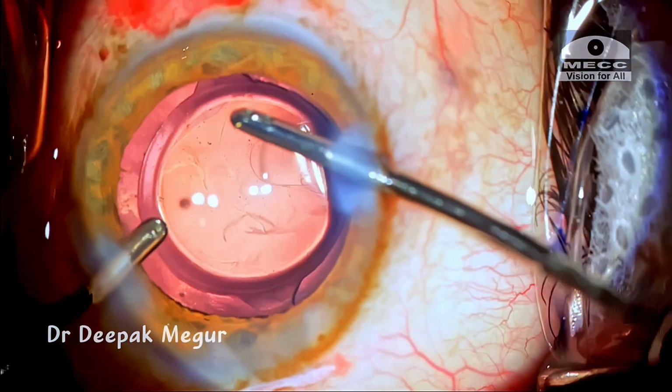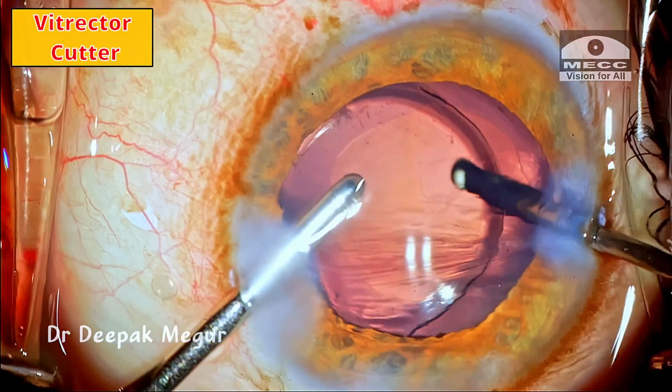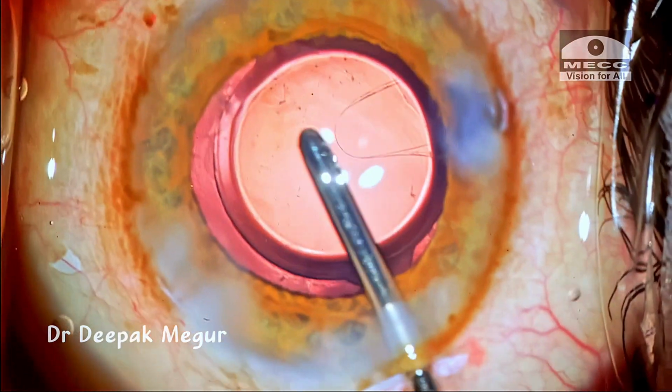Now, time to remove the OVD behind the lens. Even at this stage, we could prevent the enlargement of the posterior capsular tear. The lens is sitting in the bag and the PC tear is not enlarged.